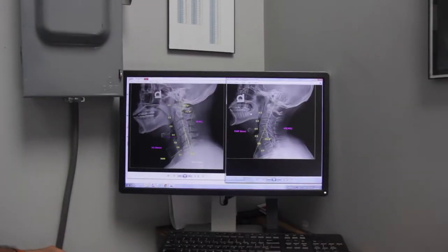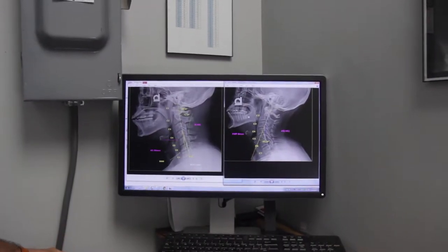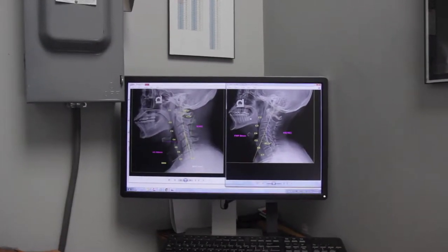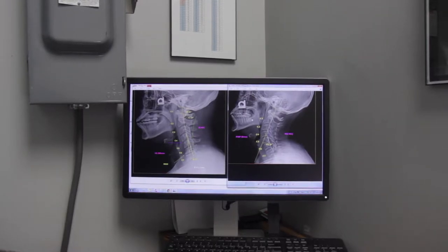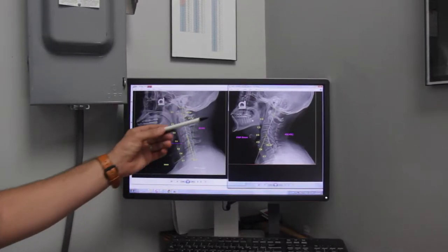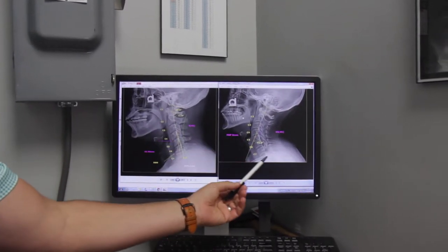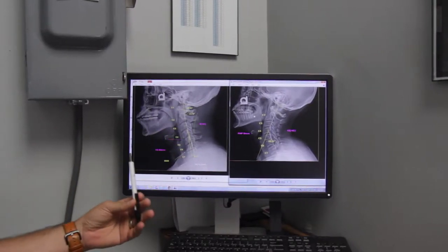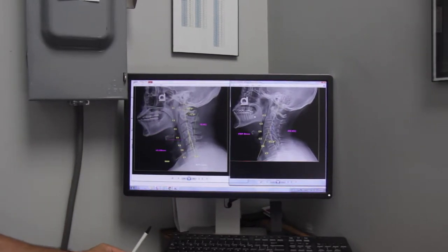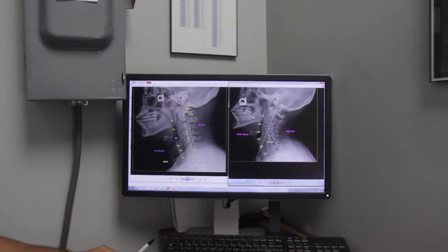Hey guys, Dr. Stetson. I just want to take you behind the scenes at how we analyze the cervical x-ray. There are four things that we look at when we're looking at the side view of the neck. What you're going to notice is our sample x-ray on the right, and then a patient, a gentleman that came in with neck pain, on the left.